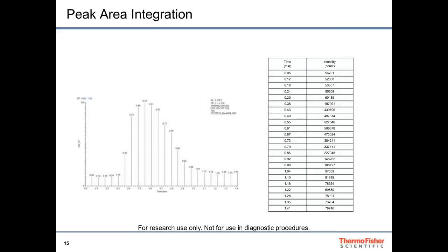As data is acquired by our LC-MS system, IRC Pro copies it and does its own peak area integration. Here we see a peak that was formed for the SRM transition 209 to 107 from a flow injection analysis of a specimen. The area under the curve is calculated by specifying a percentile of the maximum intensity so that only the intensities above the noise level of the baseline get integrated. So we're able to integrate this part very accurately and ignore the rest, which is attributed to noise.